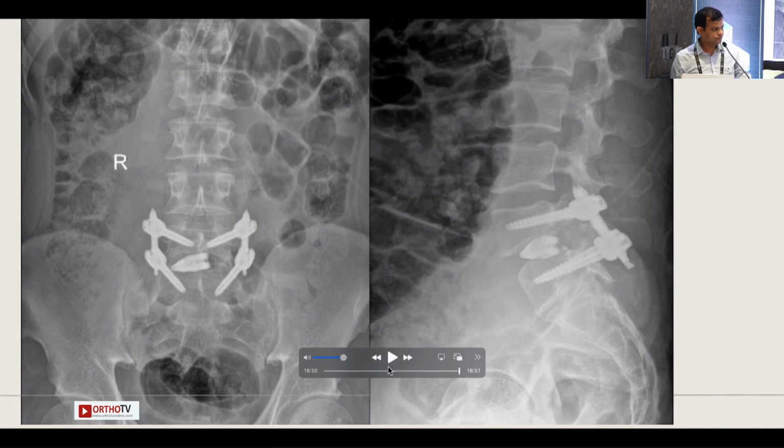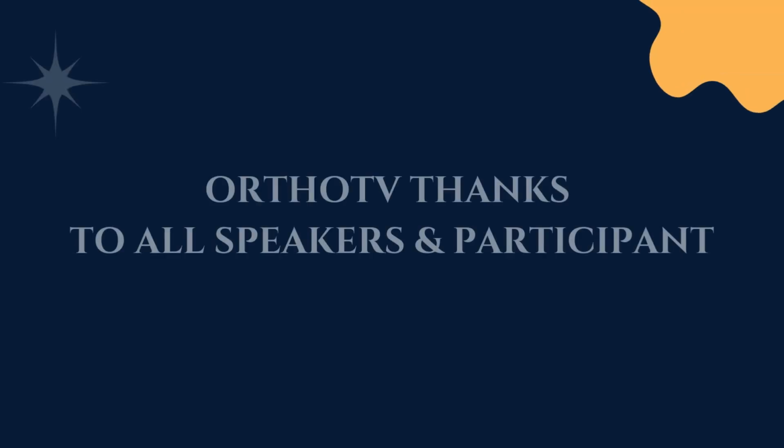And do you put the endoscope with the robot, or do you just use the initial few cases? I did in the initial few cases because I was not very confident of the exiting route. But after some time, I'm not using any scope into the tube. I just do it blindly now.